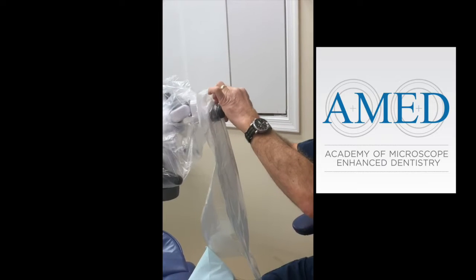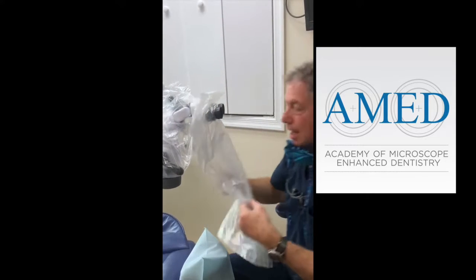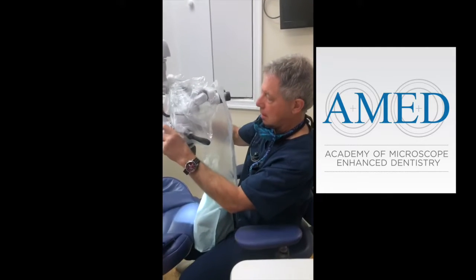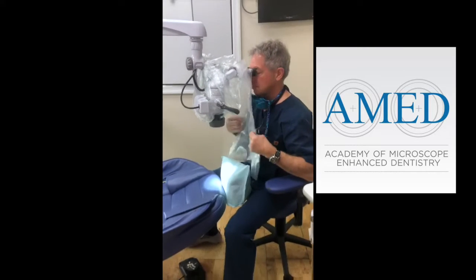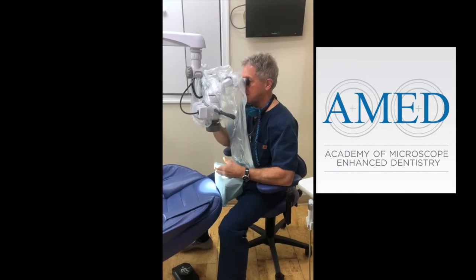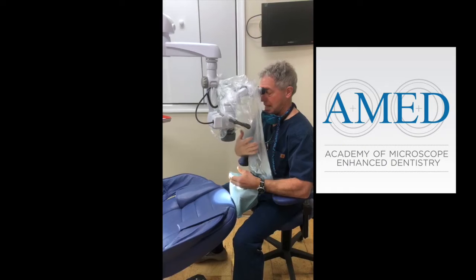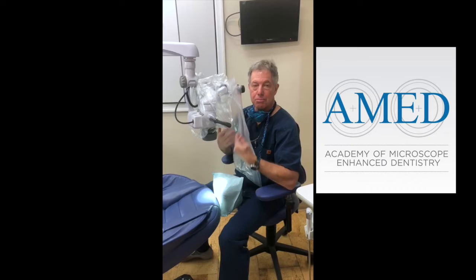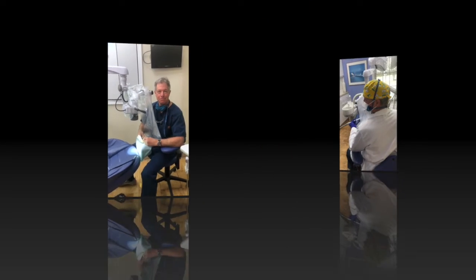Now we have a barrier so that when we're looking at the patient, when we're working, we have our hands unobstructed, we've got a clear view, and we've got an aerosol protectant — at least from direct exposure to the operator.